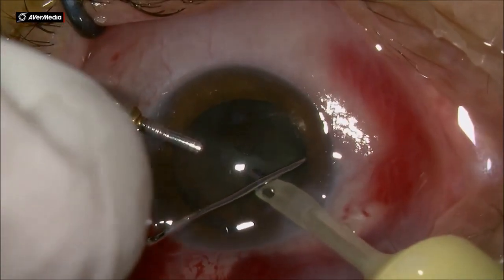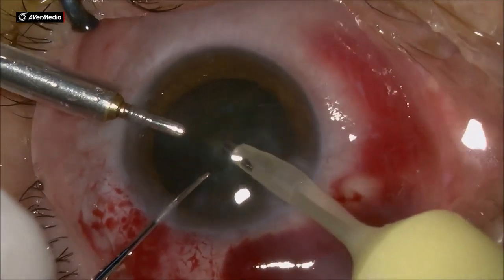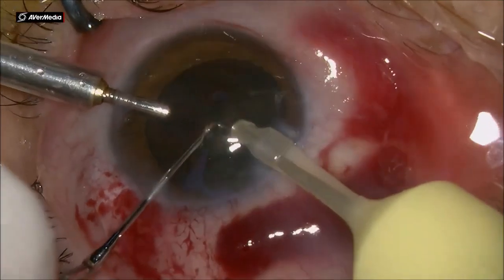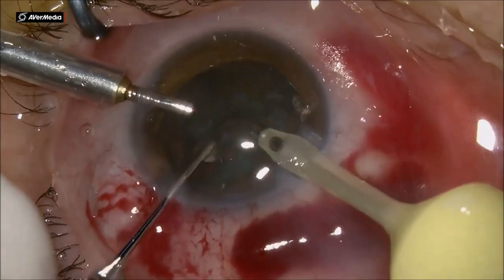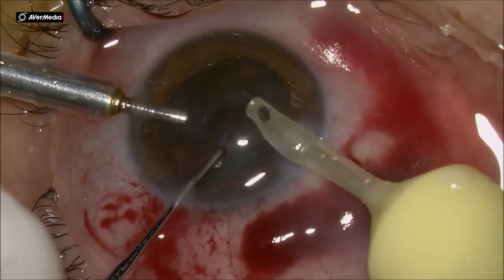Now we do a lateral chop, bringing up from the back using the long chopper, one quarter, and using this Quatera phaco machine, it's very easy to aspirate that piece out. The vacuum is set up at 700, but you can adjust it using the foot pedal as much as you want. Of course, you're not going to push it all the way down in these soft cases.